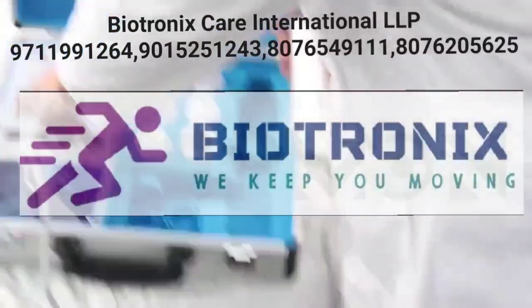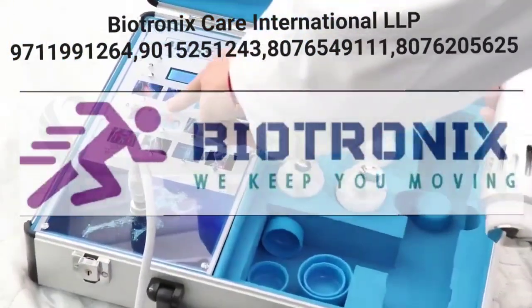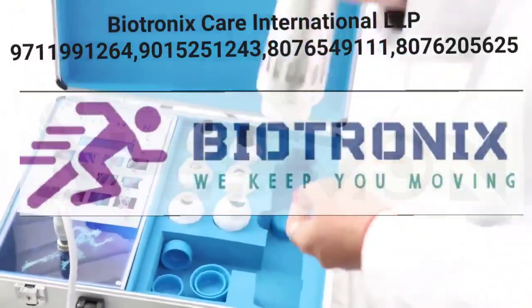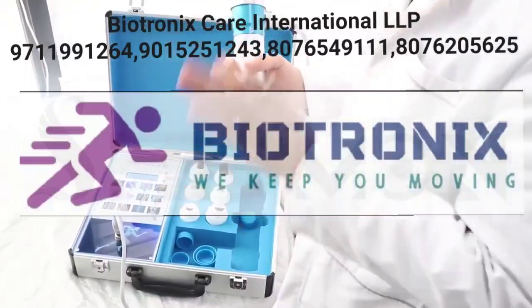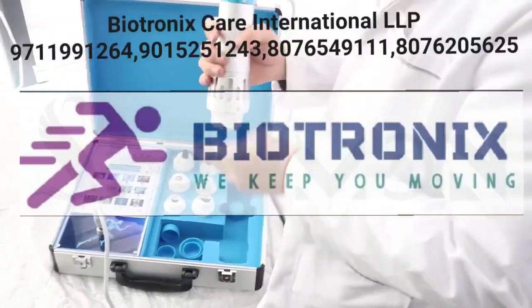You just select the button, and it fixes the data for the treatment, and then you can do a treatment on the area. Of course, if you want to do a treatment on patients, next I will show you. I will do the demo on the patient to let you know.